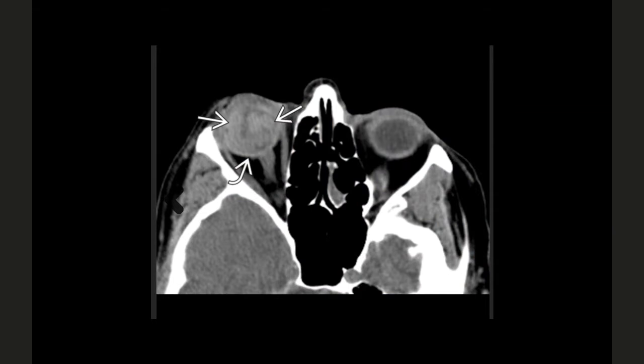As long as you say there's globe hemorrhage, good for you. It's involving the vitreous, so it's vitreous hemorrhage, great. But someone can say, is it going into the CSF and stuff? Well, we'll take it in another case, but this is for a vitreous hemorrhage or globe hemorrhage. Maybe it's also involving the aqueous humor.